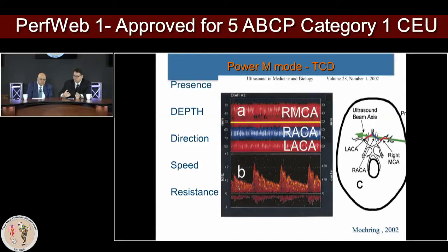So we measure it in centimeter per second. That's on the bottom screen. And the centimeter per second speed measurement is actually almost similar to miles per hour. So a normal person, how you drive on a highway when it says 60, that's kind of normal speed for our brain. The mean flow velocity we calculated from systole and diastole, and we have the expected range of mean flow velocity between 20 and 80. If a mean flow velocity, as your speed limit, goes above 80, we think there's a narrowing in a blood vessel. That's what brings this speed up. Or if you have a blockage, then when we go slower than 20, same like a traffic jam on the highway.